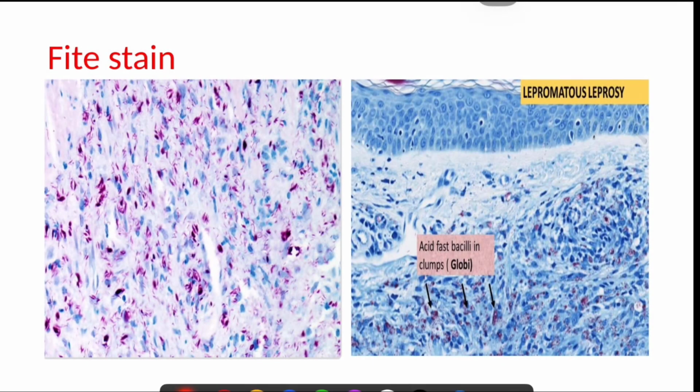Fite-Faraco stain, this is a special stain where you have to use 5% HCl concentration, where you find lepromatous bacilli.